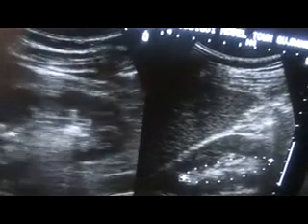I am trying to cover the upper pole of the right kidney. Ecogenicities are seen in this region as well, but they are not giving dark posterior shadow. Apart from them, we do see a small area of ecogenicity that gives posterior shadowing — this one.